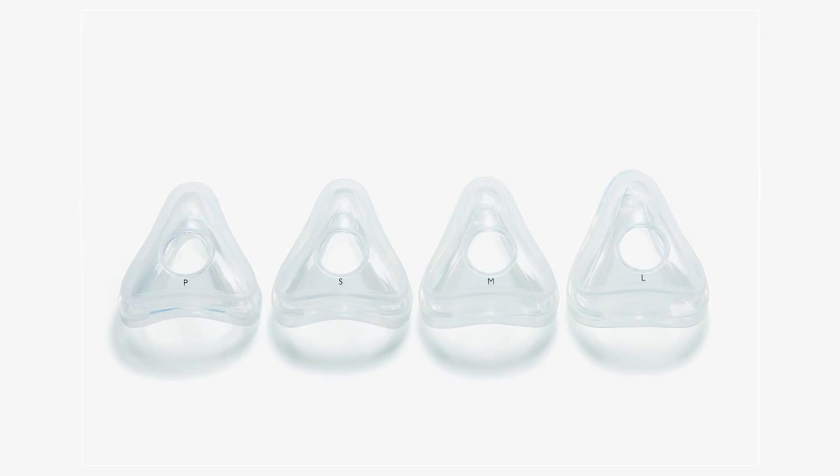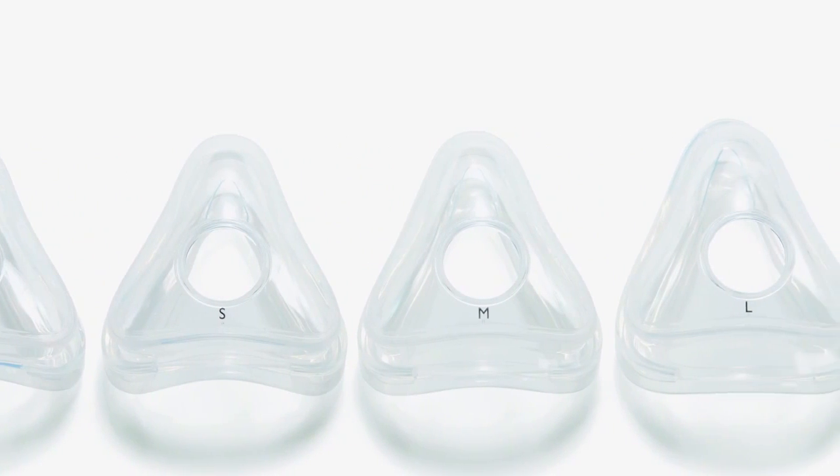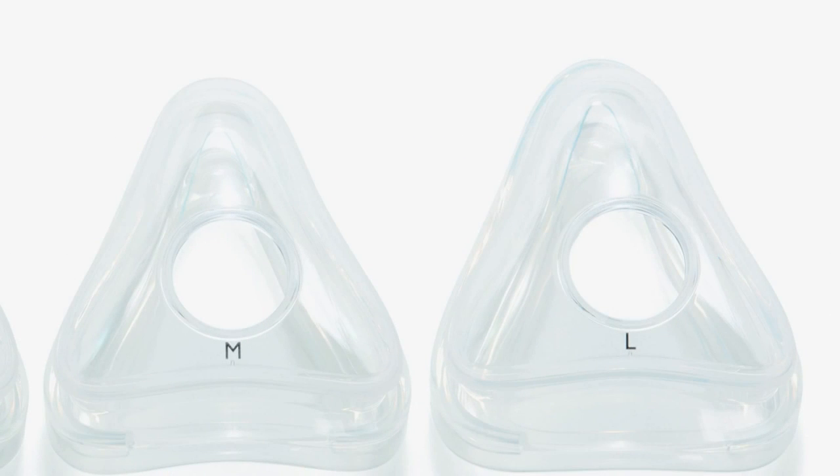The Amara Full Face Mask has four cushion sizes: petite, small, medium, and large. The size is indicated on the cushion.